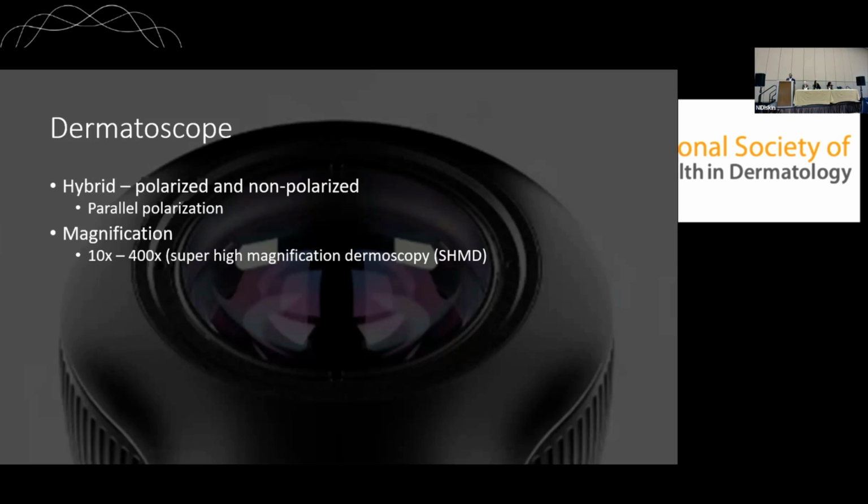But what I want to talk to you about is how dermoscopy has evolved from handheld ones to digital ones, and it has become more magnified. It's almost called super high magnification dermoscopy. I'm going to show you some examples of those.